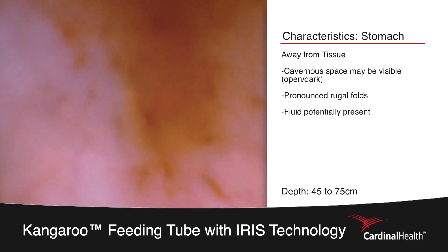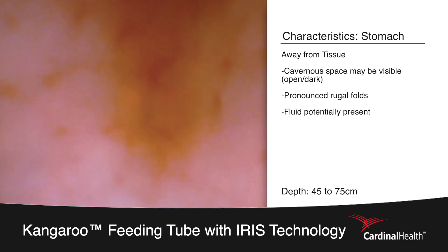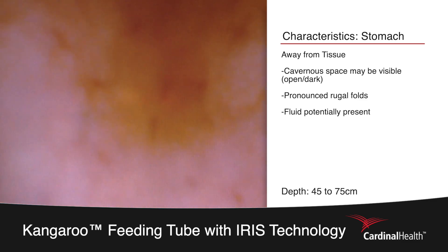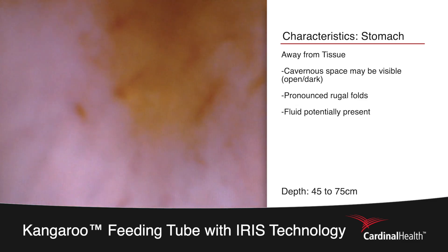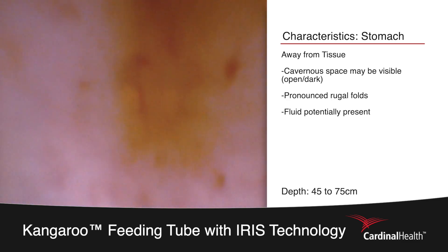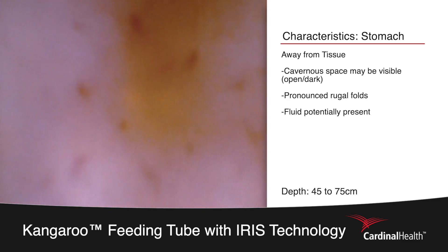The placer may continue to progress the tube down to the 70-75 centimeter mark to migrate the tube into the small bowel. If no movement is seen on the console, it's likely that the tube may be coiling and you may need to retract the tube away from the lining of the stomach or add air utilizing the insufflation device.